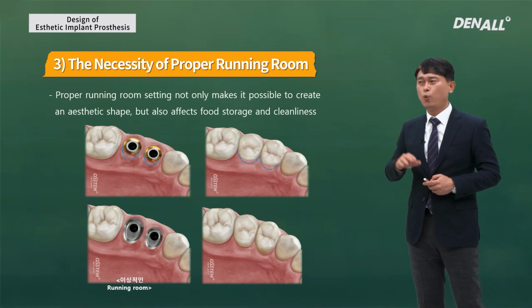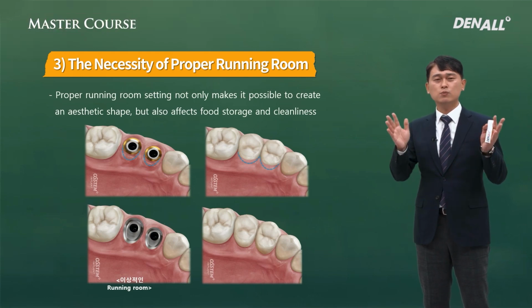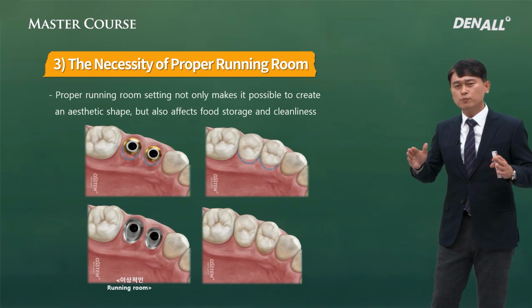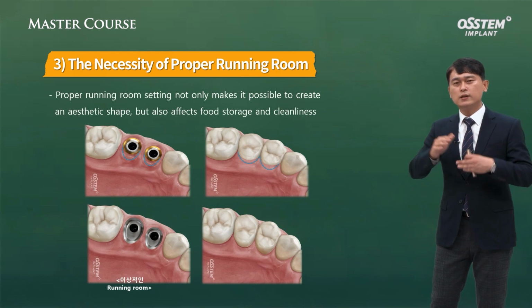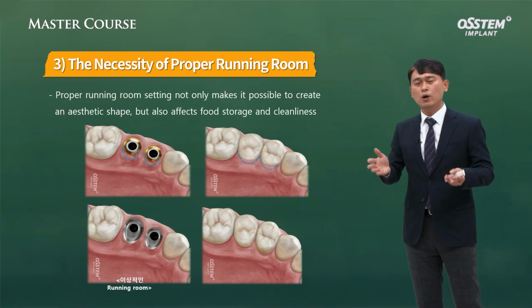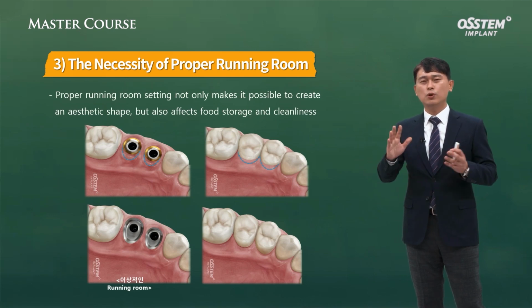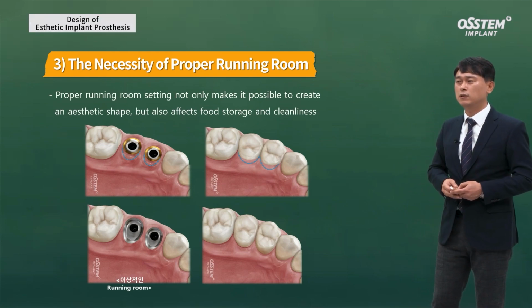So if the running room is not good, the emergence profile of prosthesis would not be ideal. So emergence profile should be considered for the running room, and the buccolingual width should be sufficient enough for beautiful emergence profile. It will lead to ease of maintenance and cleansing, and it's very important to preserve surrounding tissues.